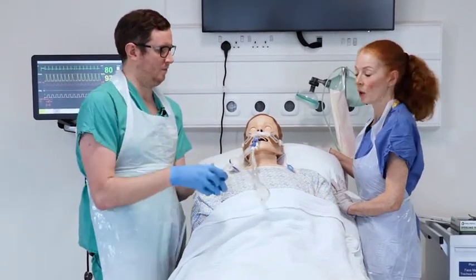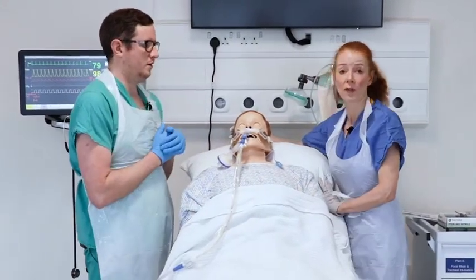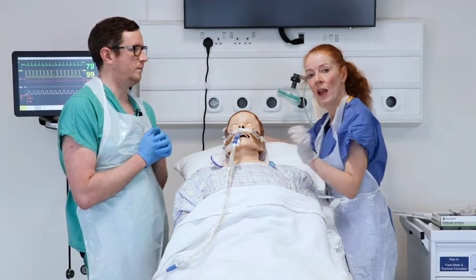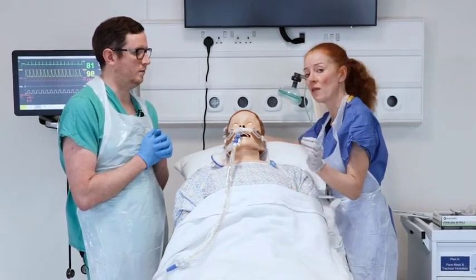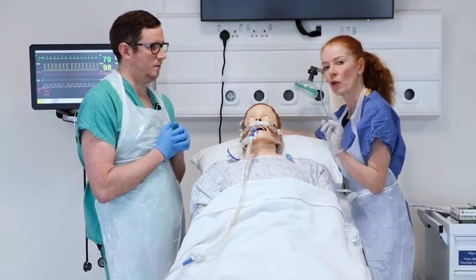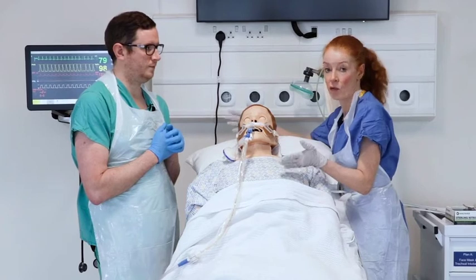The suction pressure must be set between 120 and 150 millimetres of mercury. Every time you pass a suction catheter into the patient's airway it can cause damage and over time may even ulcerate the trachea. So it's very important to consider: first, does the patient really need suction? And second, is the suction pressure set at the correct range?